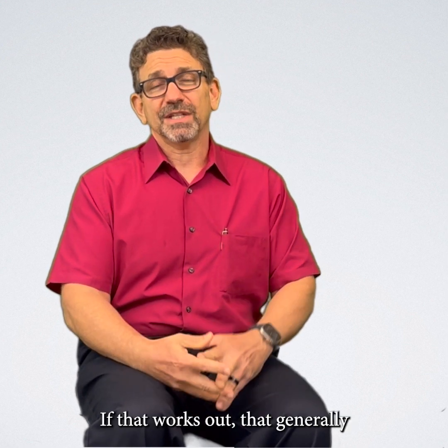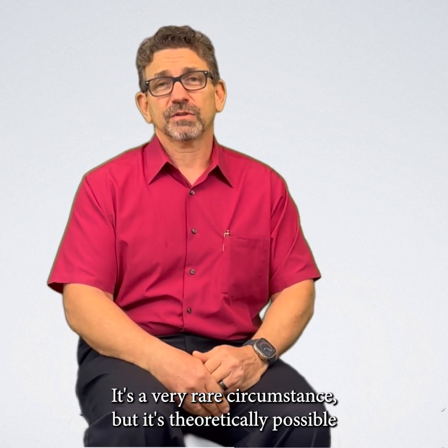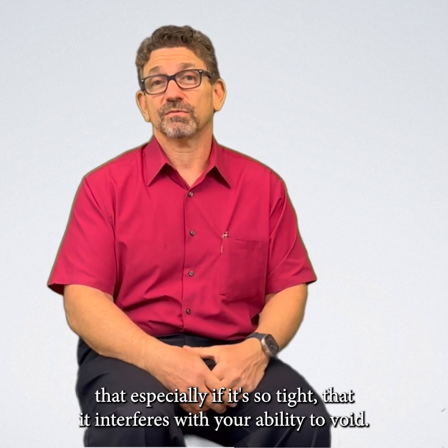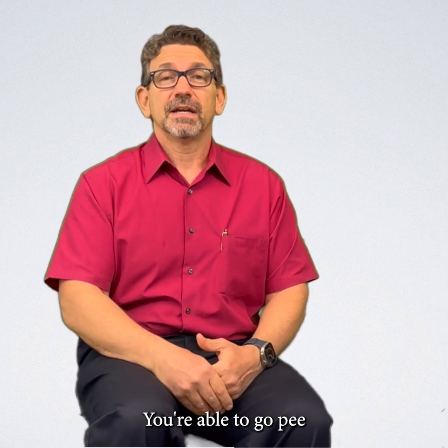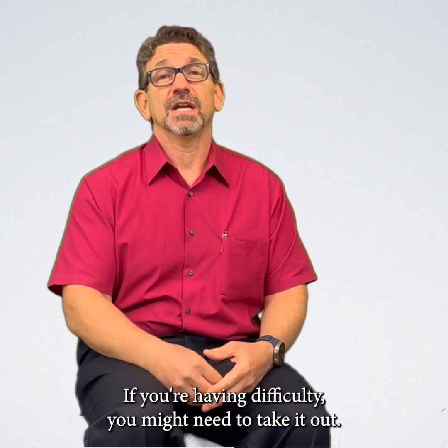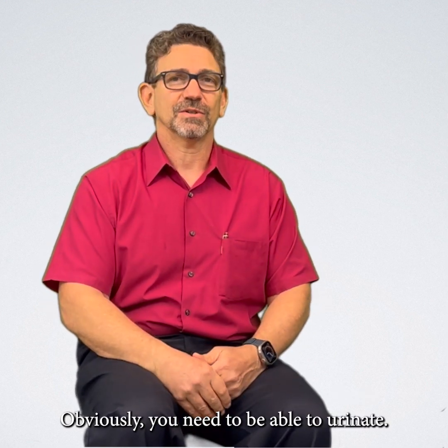If that works out, then generally I see patients a week later to make sure they're doing okay. It's a very rare circumstance, but it's theoretically possible that a pessary fits so tight that it interferes with your ability to void. So if you just have a new pessary, make sure that you're paying attention, you're able to go pee within the next 6 hours, drink some fluids. If you're having difficulty, you might need to take it out. If you can't, then you need to go back to your physician. Obviously, you need to be able to urinate.